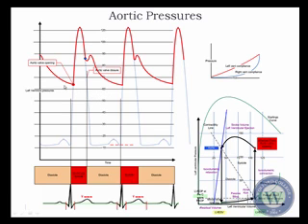But in normal circumstances, if the valve opens, the ventricular waveform will mimic the actual height of the arterial wave. And that's very important for you to understand because it would indicate to you the health of the ventricle. So one of the things that I teach my master's students here is that I want them to look at the arterial waveform to try to determine the health of the ventricle.